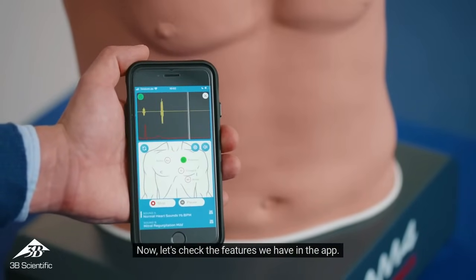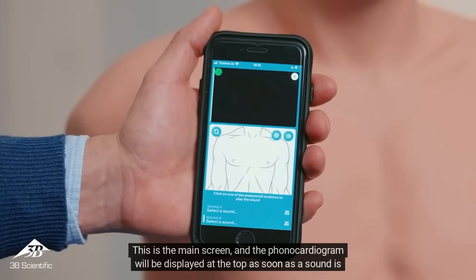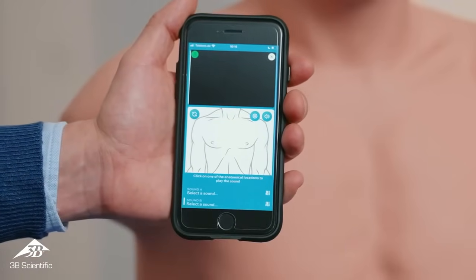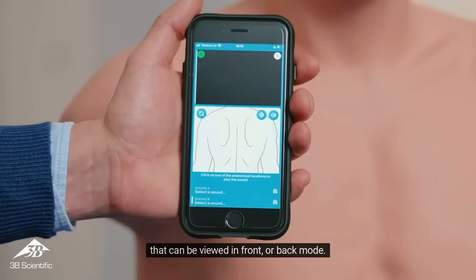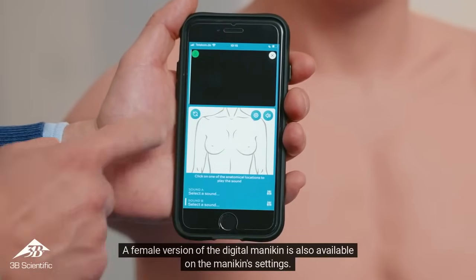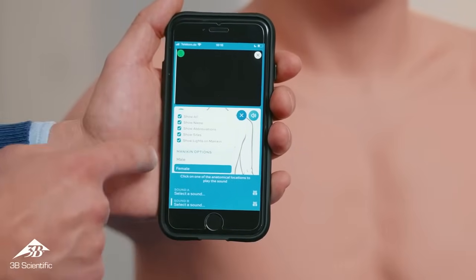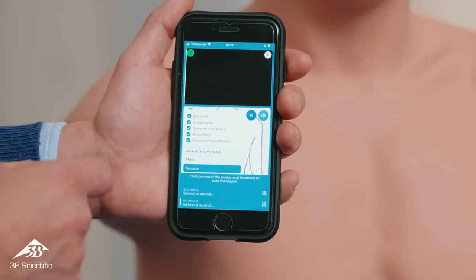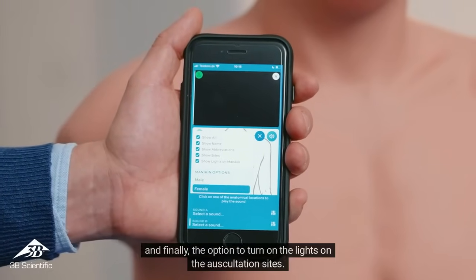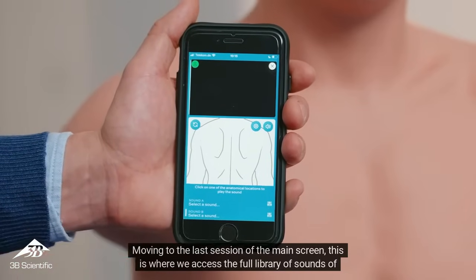Now let's check the features available in the app. This is the main screen, and the phonocardiogram will be displayed at the top as soon as a sound is selected in the library. In the middle, the digital mannequin is displayed, and it can be viewed in front or back mode. A female version of the digital mannequin is also available in the mannequin's settings. Additional options in the settings menu include the visualization of names, abbreviations, and sites of the auscultation points, as well as the option to turn on the lights at the auscultation sites. This is also where you access the full library of sounds for SAM-4.